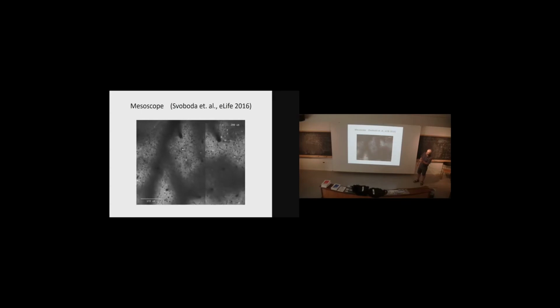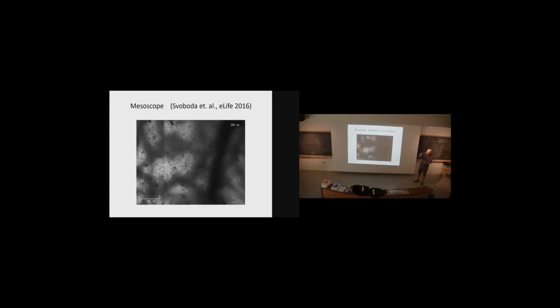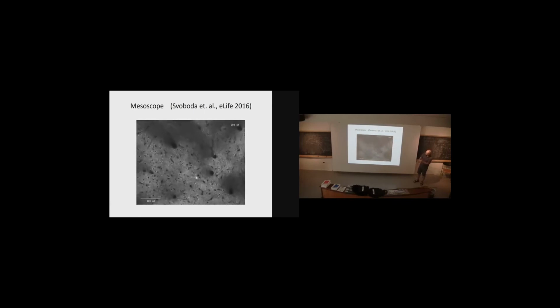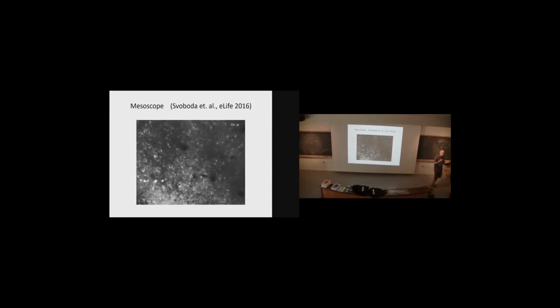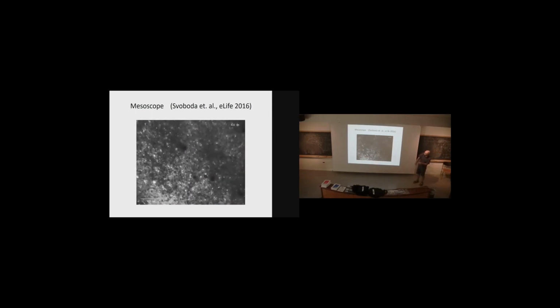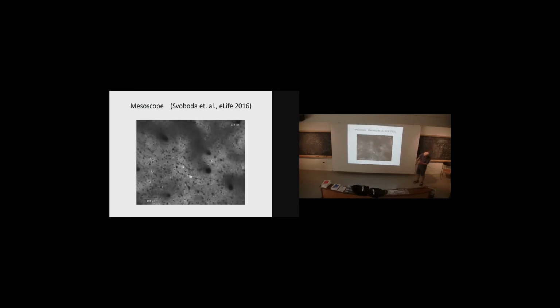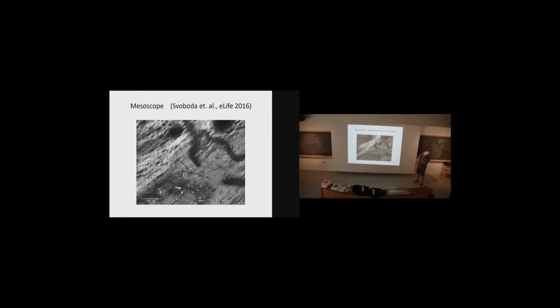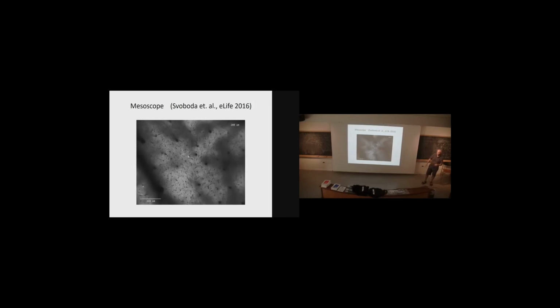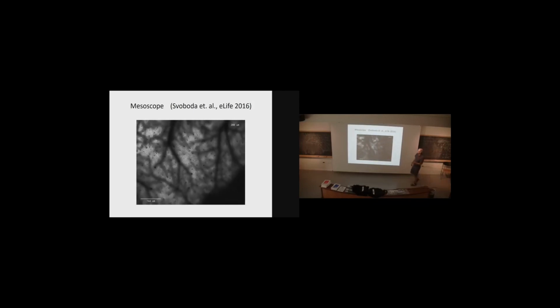Right? These are neurons. They're tagged with a fluorescence marker that changes its intensity when the neuron becomes active. Right? And you'll see that these neurons will become active. And see, now the neurons are active. You're looking at the mouse thinking. Right? All these neurons are active, and they're focusing in and out. They go in deeper, and now they're focusing out. You see all the activity of the neurons, all these neurons, now they're focusing out. You see the blood cells, these dark regions are the blood cells, and then that was the surface that you just saw. Right? Two photon, yeah.